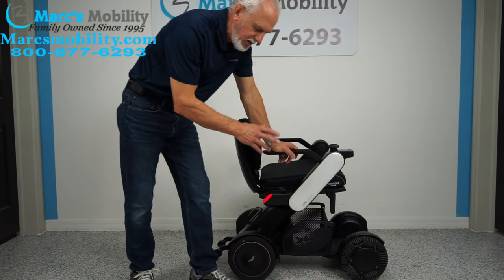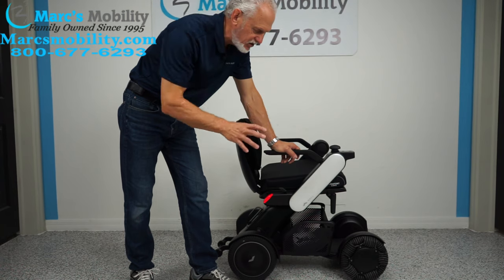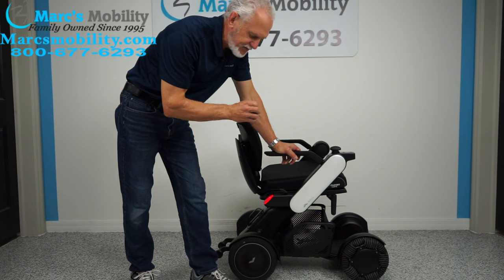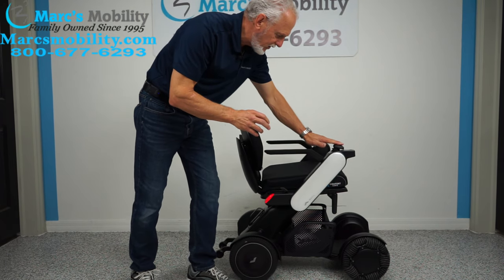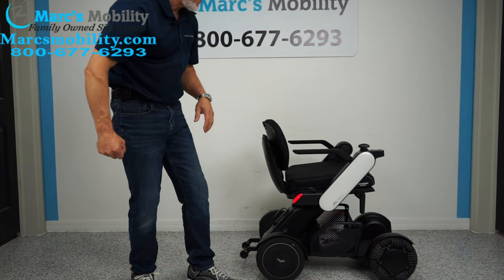This chair has independent suspension — all four wheels have their own suspension. It also has electromagnetic brakes, so when you let go of the joystick, the chair brakes automatically. It's got electromagnetic brakes built right into the motors.